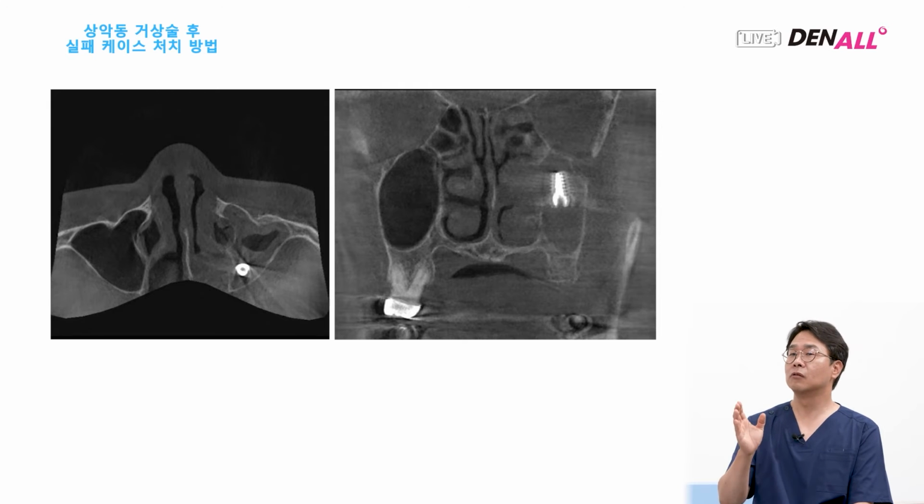Diagnosis is very important, and we need to make a big access incision or hole. If you are hesitant on where that might be, you will not be able to find the implant. Once you make a good diagnosis and the direction is set, you need to go in there aggressively. Exact position should be identified, and you need to get a good operation plan, right?